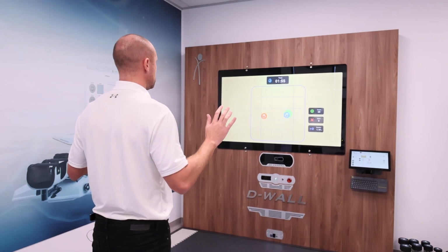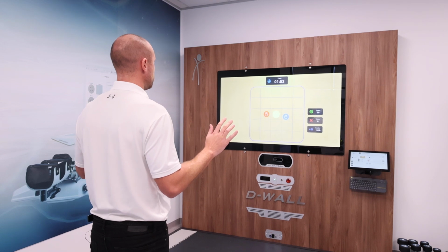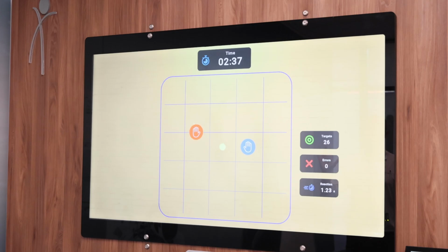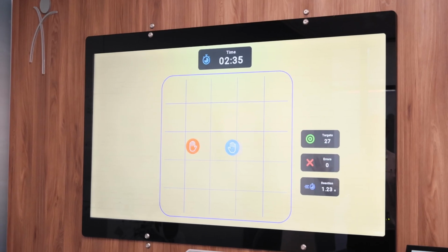We are now going through an exergame called upper limbs. In this game, we require the patient to use the upper extremities to reach targets in different positions, to work on different ranges of motion. The software will display different yellow targets and the 2 hands of the patient. Through the hands, you can reach the different goals, the different targets on the screen.